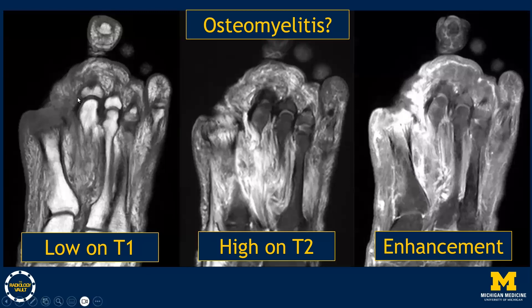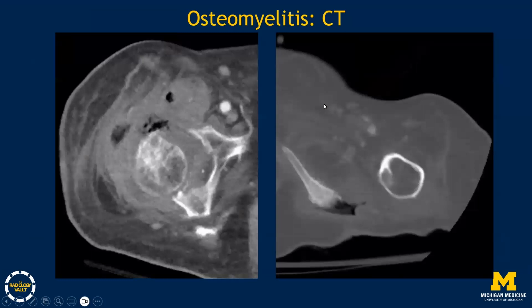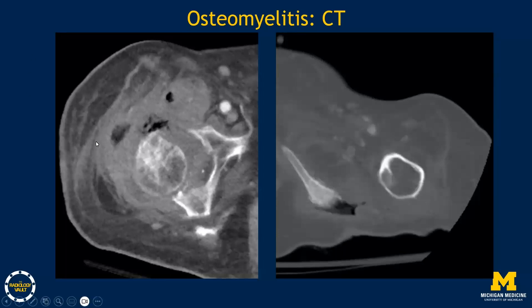Another example shows axial foot MRI images from a patient with an ulcer over the first metatarsal head, demonstrating marrow replacement on T1-weighted images with edema and post-contrast enhancement — the signal characteristics consistent with osteomyelitis. Regarding CT findings: we look for lucency and erosion in the acute setting, and chronic changes like sclerosis. One case shows soft tissue gas and hip joint effusion suggestive of septic arthritis with patchy lucency and early erosion of the femoral head. Another shows a decubitus ulcer with gas tracking to a sclerotic ischial tuberosity and periosteal reaction consistent with chronic osteomyelitis.